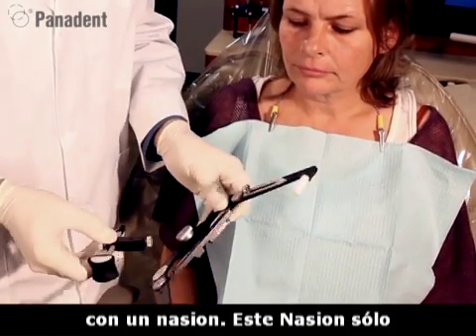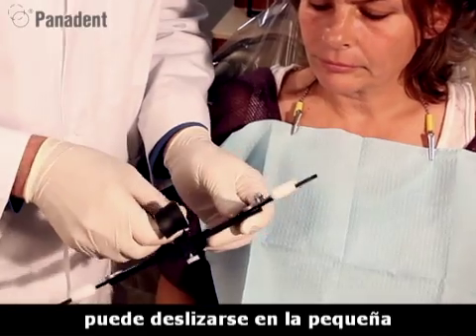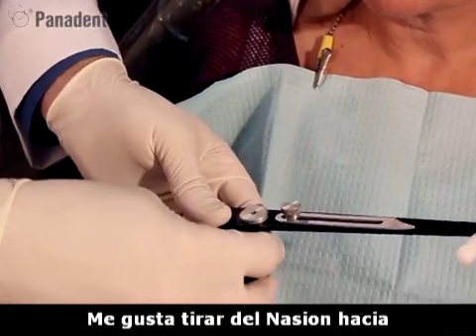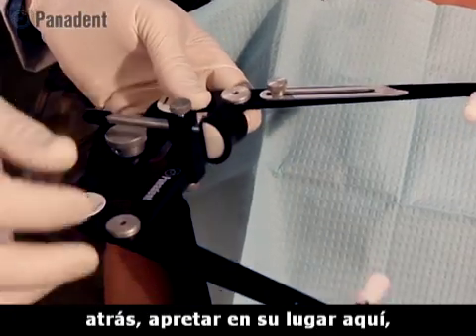This nasion relator can just slide into the little slot section here in the front of the face bow. We can tighten it in place here. I like to pull the nasion back away and tighten it in place.